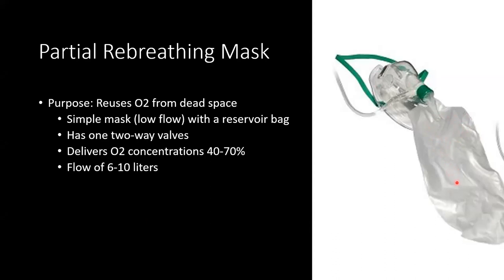So when a patient breathes in, the patient will now inhale the oxygen that's coming from this bag as well as from the wall. And as the patient breathes out or exhales, this bag will therefore inflate. Okay, so when does this bag inflate again? It should inflate on the patient's exhalation. Why is it inflating during the patient's exhalation? Because the first third of the exhaled volume is going to go into this bag. Do you understand?